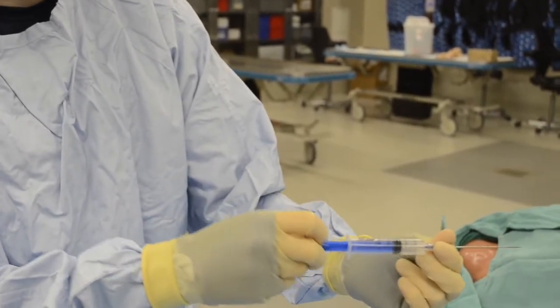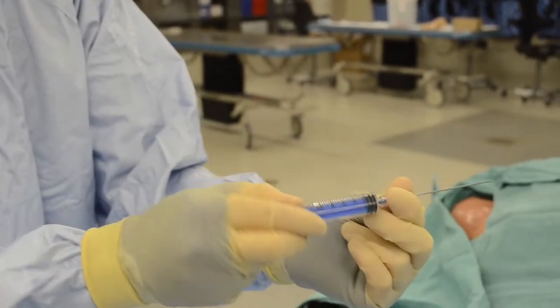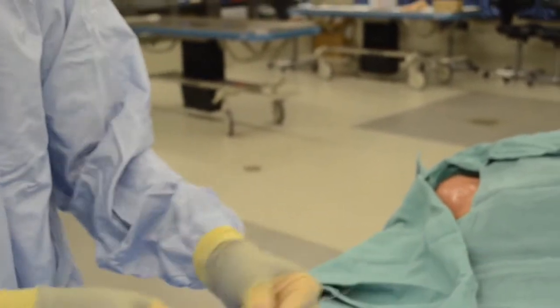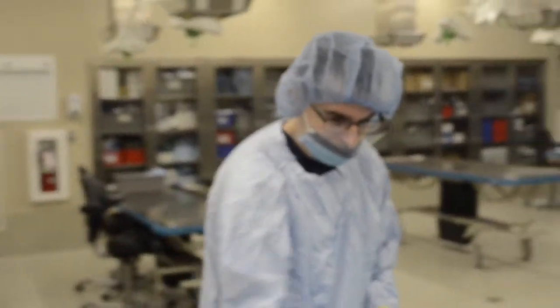I'll just do that one more time so you can see. Bevel. Up. Bevel's up, just where the numbers are. That's right, Dr. Miller. And we'll put this right aside so that we're ready for it.